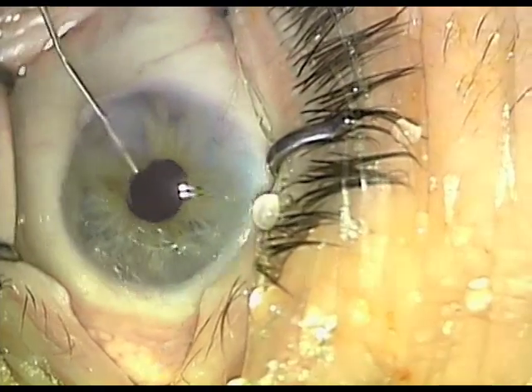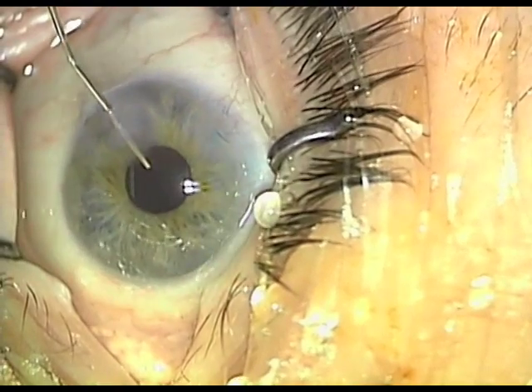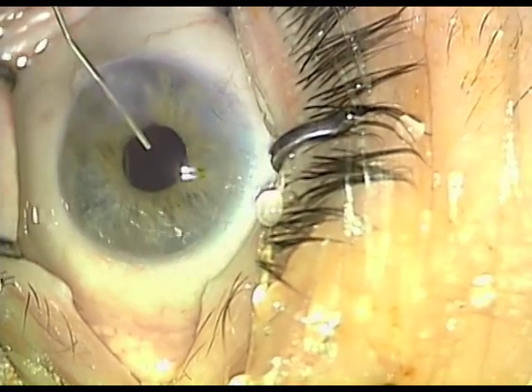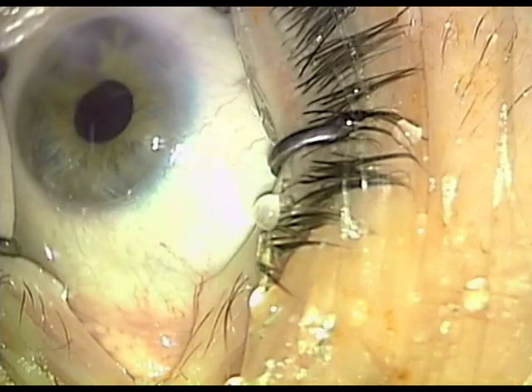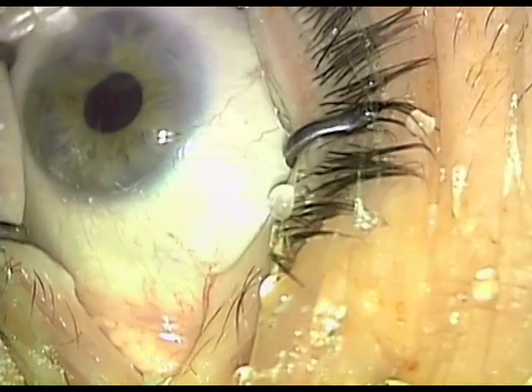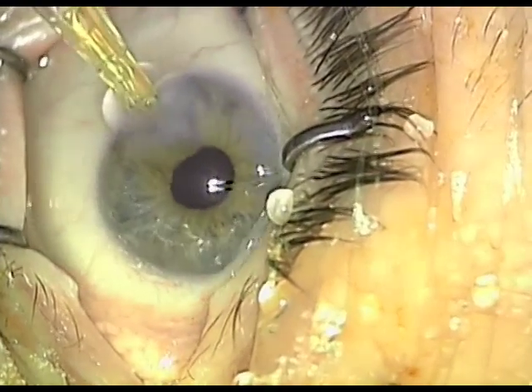This is a patient that actually has nystagmus, as you can see. We will fill the eye with viscoelastic and place the intraocular lens in position, then hydrate the wound and we can then exit safely.